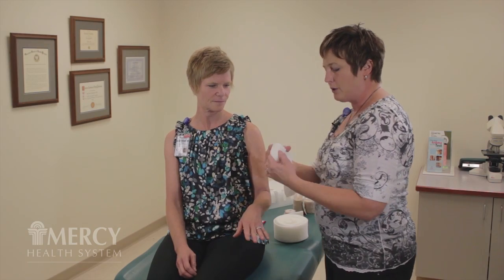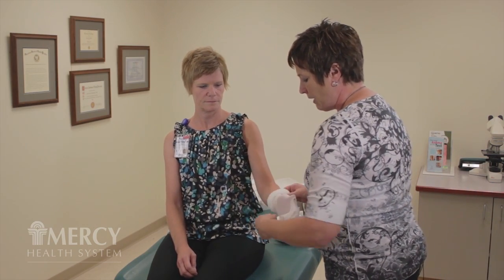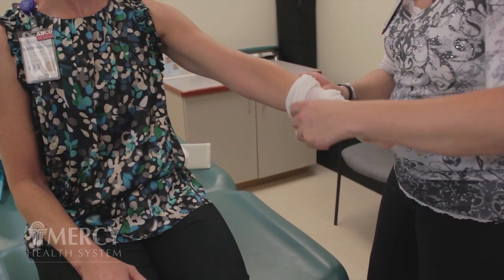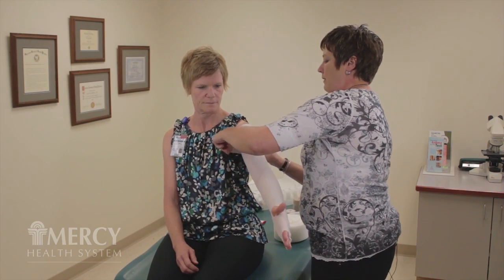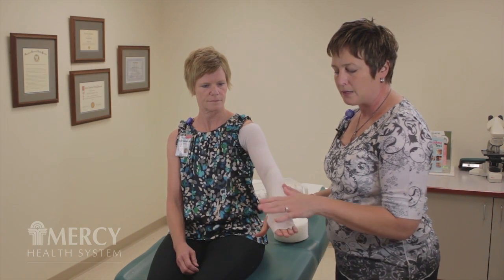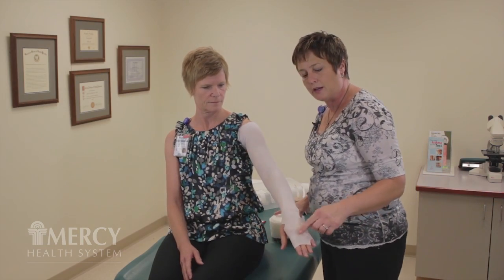The first layer we're going to put on in the multilayer bandaging sequence is stockinette. It's a non-elastic stockinette that helps absorb perspiration. This is going to extend from the hand — there's a little thumb hole — all the way up to the armpit. I'm going to leave a little extra at the top and a small amount at the bottom because the second layer is going to be foam. Once the foam is placed, we want to protect the ends of the foam with that extra length.